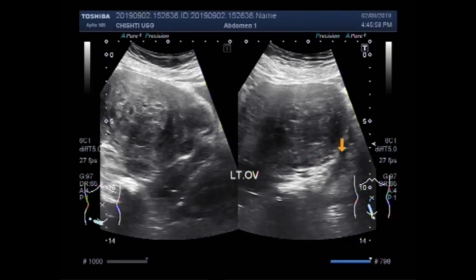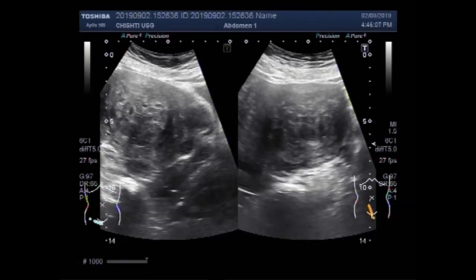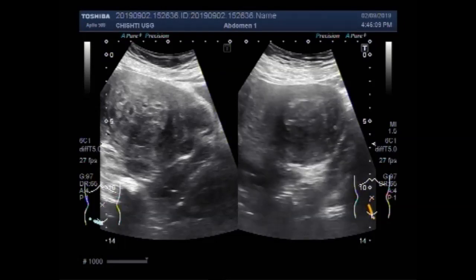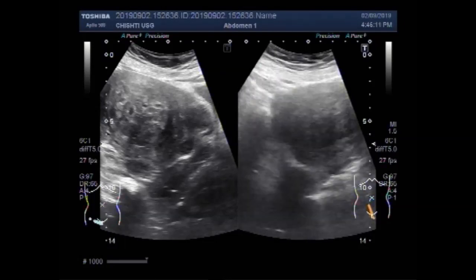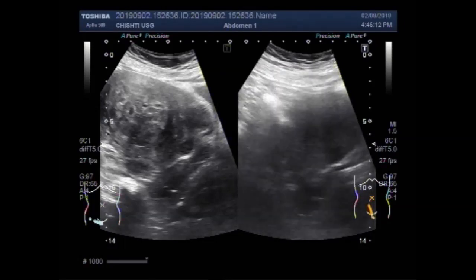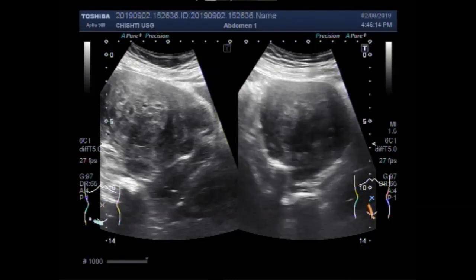This is the left ovary and this one is the right ovary. The ovaries appear echo-normal.